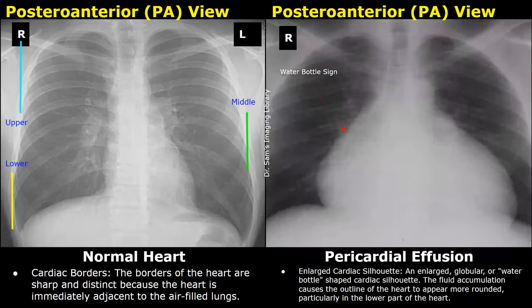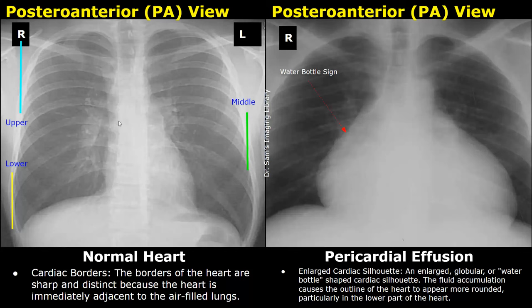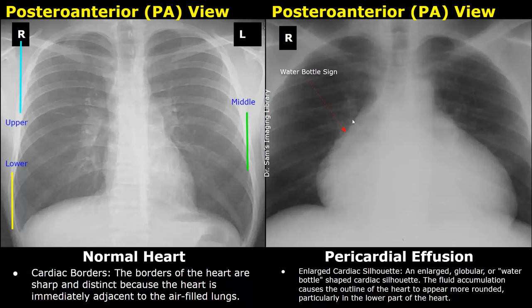In pericardial effusion there is an abnormal accumulation of fluid within the pericardial cavity, which can be detected on a chest X-ray. The normal cardiac borders are sharp and distinct because the heart is immediately adjacent to the air-filled lungs. In cases of significant pericardial effusion, an enlarged globular heart is seen with a water bottle-shaped cardiac silhouette, due to fluid accumulation making the outline more rounded especially at the lower part — this is known as the water bottle sign.